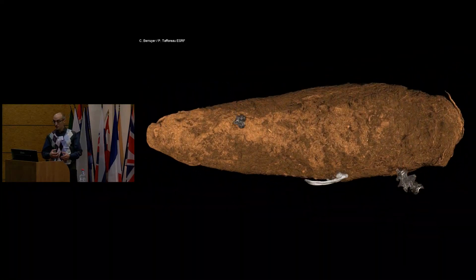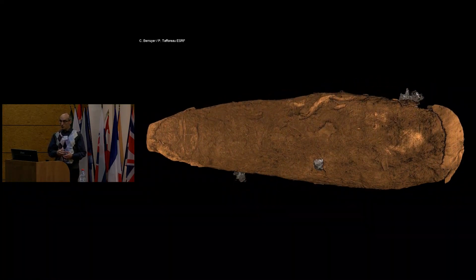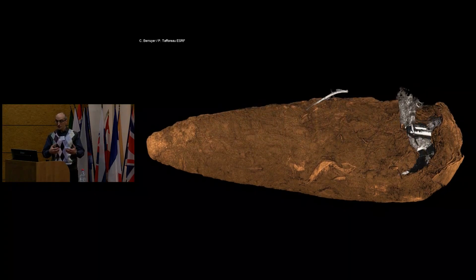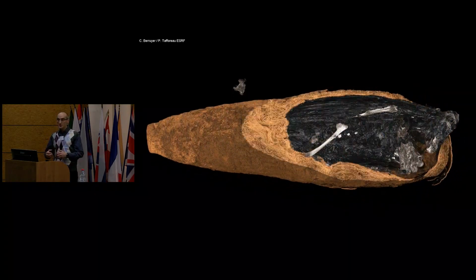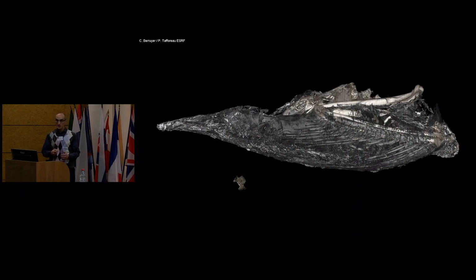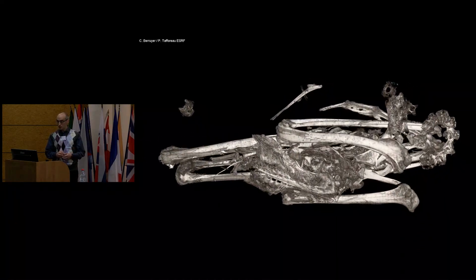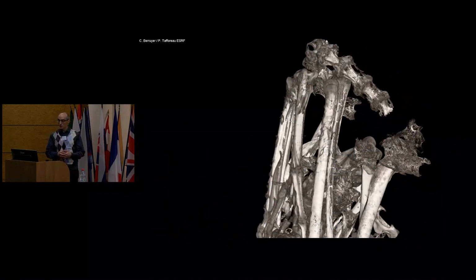And what remains is the wrappings, the tighter wrappings around the mummy, with some bones protruding in this case. And again, these can be removed because everything that is segmented separately can be seen separately. This is the key point behind all this. So once you remove those, you can see the soft tissue. You remove that, you start seeing the bones.